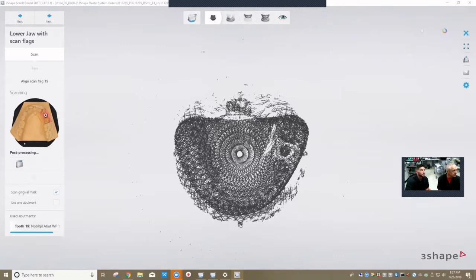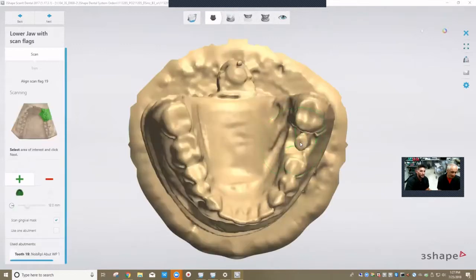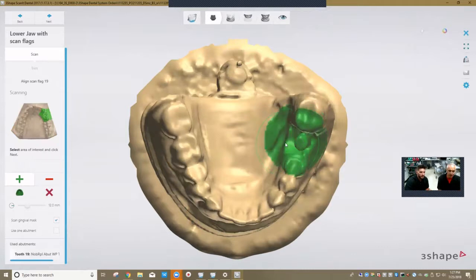When you place the model, does that have to face a specific way? Generally, if you want the best scan, you want the implant towards the center of the scan plate, in the center of the scan plate. That's when you're going to get the best scan. But as far as facing, I would say the anterior is facing the back of the camera. It's how the scan plate is shaped. So you want the back of the model facing the flat side of that scan plate, and the scan body centralized.